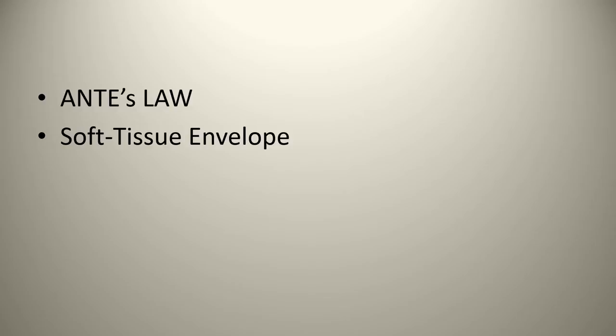The solution for this is ensuring that when you're communicating with your lab, they provide you with a crown that's going to contour right up to the implant fixture. As we talk about in some of the cases we've presented in this lecture series, you'll see how tissue goes white when I insert a lot of crowns in. The basic purpose is to make sure there's intimate contact between the prosthetic and the soft tissue, so that things aren't getting stuck inside there and you're getting that proper soft tissue envelope.